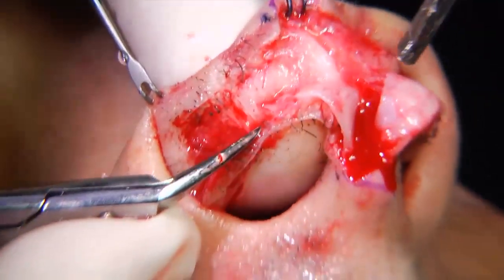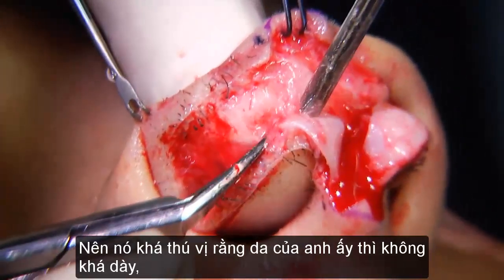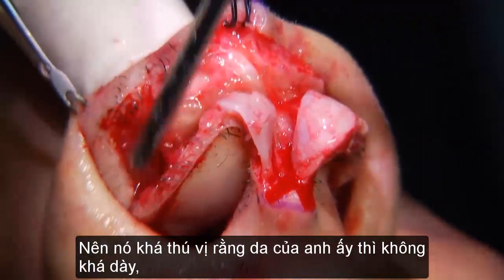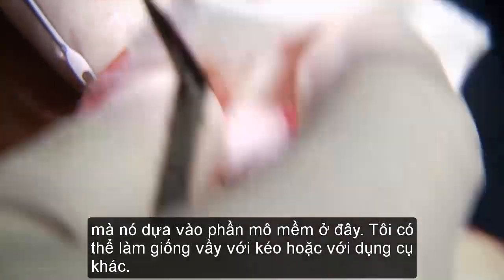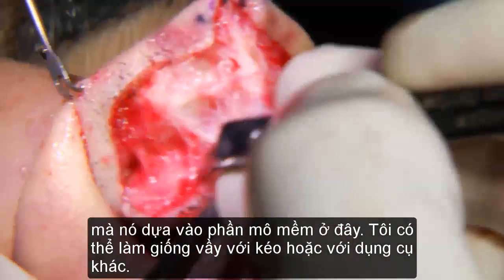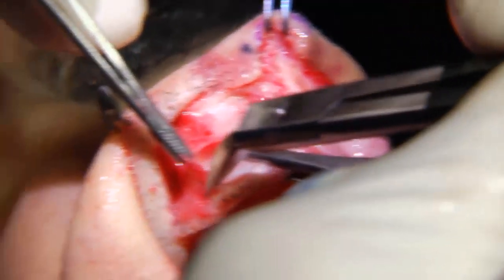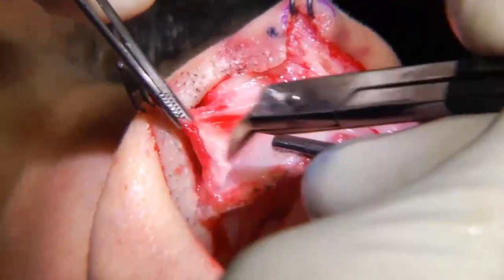So it's interesting that his skin is not that thick really, and that there's a lot of mass, depending. I can do this with the scissors or with some other instrument, and I just peel off.